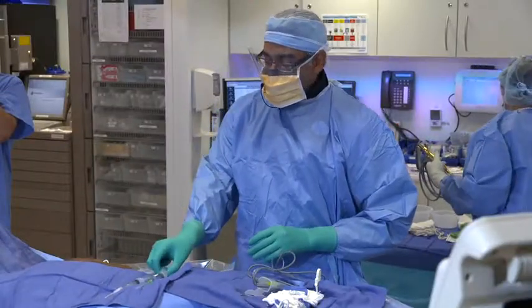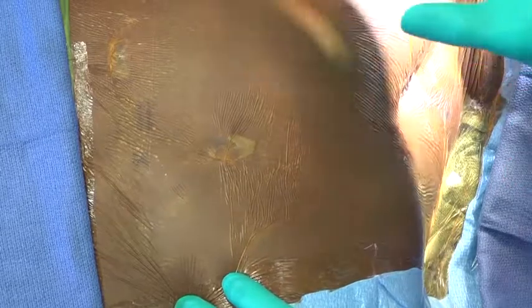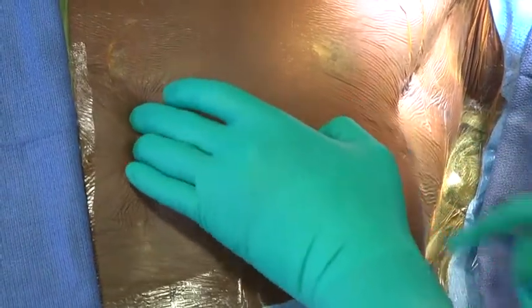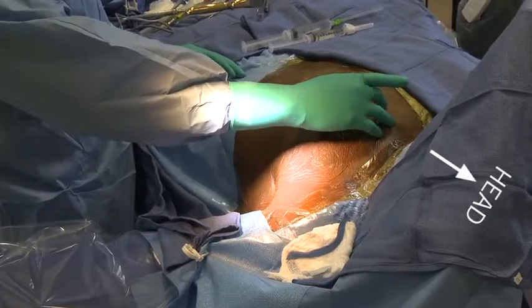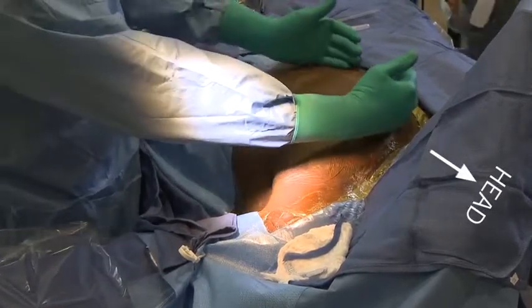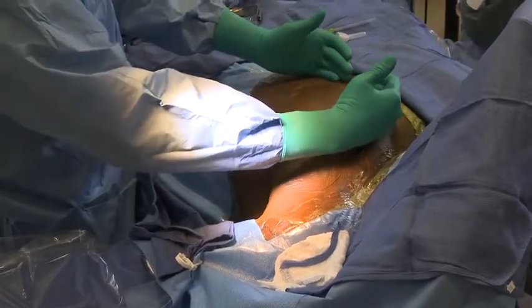We've finished the prep — it's a nice wide prep because we really have about three operative sites to work on. We have the pocket down here; the top of the pocket is about where my index finger is. This is the inferior incision just above the xiphoid, and this one is just here by the suprasternal notch. We need access to all those areas. One thing you don't want to do is encroach too closely, because you need to work and may have to adjust the lead position a little bit.